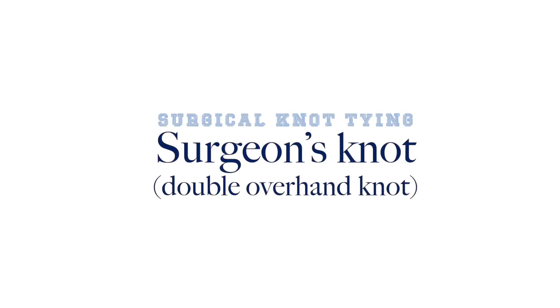In this video we are going to show you how to tie a surgical knot using the surgical double overhand knot.